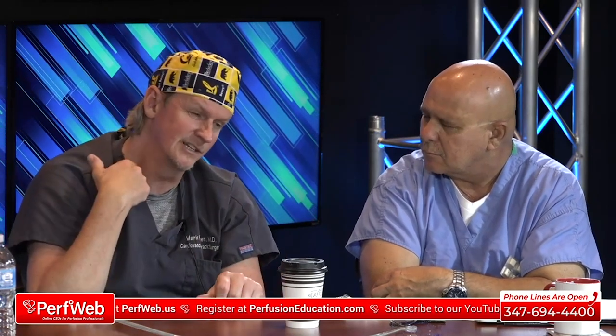But she's got a little incision in her neck. She's got a little cut in her groin, so she'll probably bleed from that. So it'll probably just be suction and keep her on anticoagulation with the EKOS. Her leg, to be honest with you, because of her size, it's hard to tell if she had significant swelling. She's just kind of big everywhere, but definitely getting a filter. Did she still have some peripheral clots? Oh yeah, from her left femoral down.